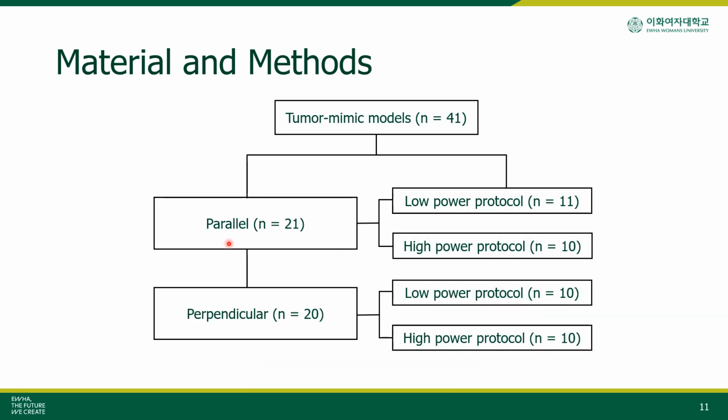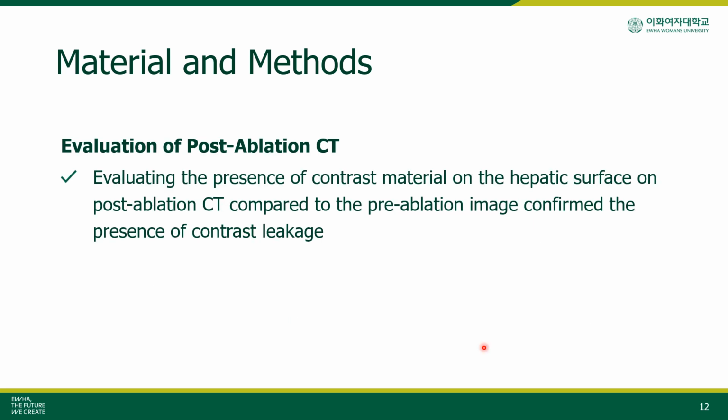Parallel access with the low power protocol was applied to 11 tumor mimic models, parallel with high power to 10 models, perpendicular with low power to 10 models, and perpendicular with high power to 10 models. The presence of high-density contrast material on the hepatic surface on post-ablation CT compared to the pre-ablation image confirmed the presence of contrast leakage.